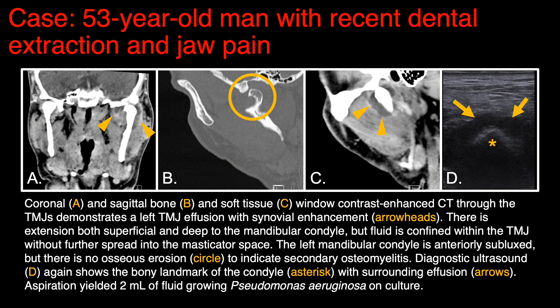Here's another case — a 53-year-old man who had a recent dental extraction and presented with subsequent jaw pain. In image A, we can see a coronal contrast-enhanced CT view demonstrating a left-sided temporomandibular joint effusion with synovial thickening and enhancement. Image B shows bone windows in the sagittal plane with no bone erosion or other evidence of bone involvement. The sagittal plane soft tissue windows again show the low-density joint effusion with thickening and enhancement of the joint synovium. On ultrasound, similar to the first case, the mandibular condyle is identified with a surrounding hypoechoic effusion. Aspiration yielded 2 milliliters of fluid, which was positive for Pseudomonas aeruginosa on culture.